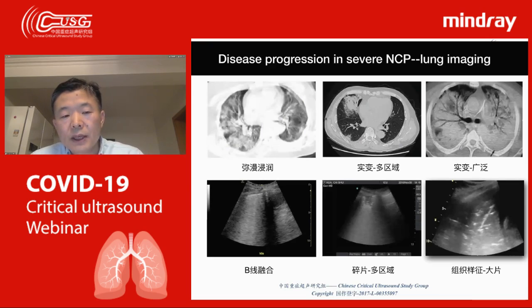In this area, you try to think about not only using your probe to point to one area of your patients. You have to think about the whole lung, from the upper part, from the lower part, from the lateral side to the back side. I think it's very useful. And also you have to think about the A line, B line, also consolidation, shred signs, and the other things. Put all these things together.